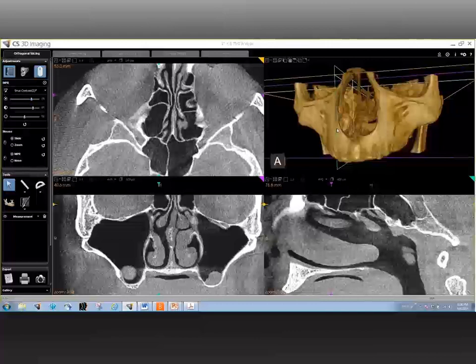So a higher resolution sensor like our RVG 6100 or 6200, which offer greater than 21 line pairs per millimeter, would be the best option for identifying caries. That is correct, and the key being a high resolution sensor would be the best way to go ahead and choose the highest resolution and the fastest receptor, and do intraoral images with that. So, simply put, the answer is yes.